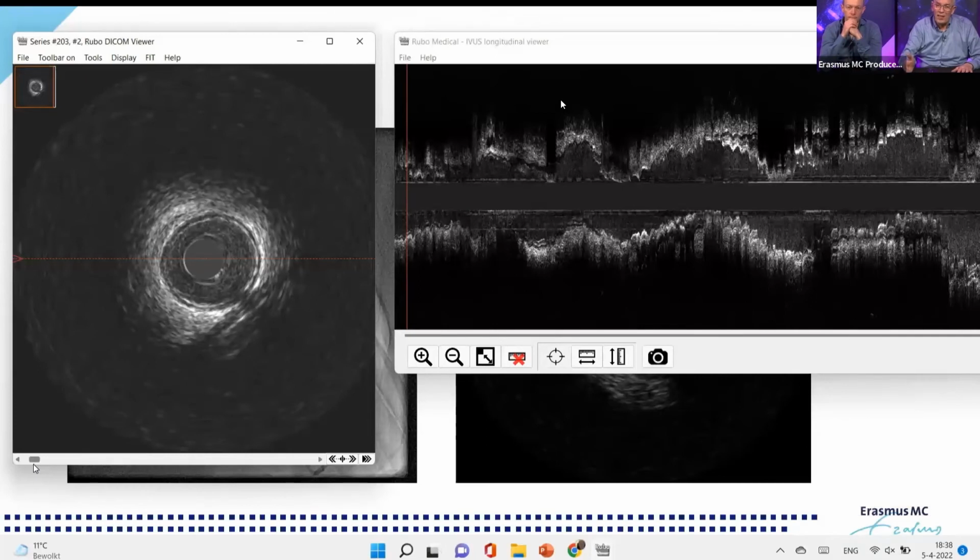And that goes better if you sit down during the procedure to watch that, if your patient is stable, of course, and of course you have your staff to watch over the patient, but then you can really appreciate your imaging. And then, of course, afterwards, when we look at that in the imaging meeting, you always find extra things like that. But that's offline, always reviewing. Exactly.